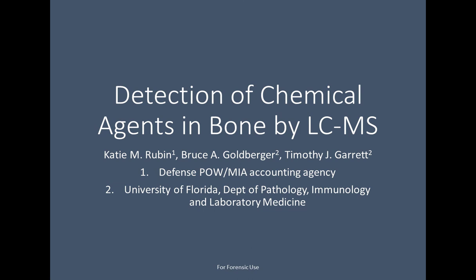But with the work we did, I think that high-resolution mass spectrometry will have a strong future in the clinical world, and I think it's for a couple of reasons. One, the dynamic range of high-resolution instruments is getting wider. So we're able to capture a larger concentration range, which is very important, especially in this kind of study. Sensitivity is getting much closer to those of a triple quad. The triple quad is still the most sensitive instrument that we have.